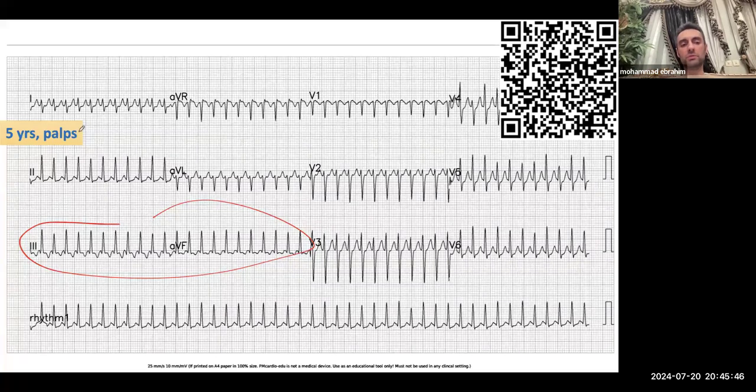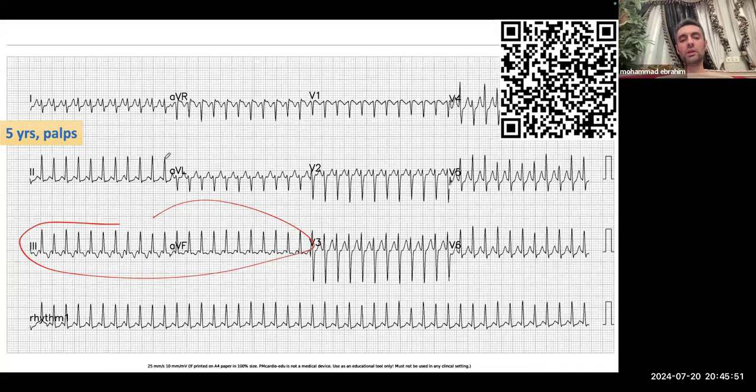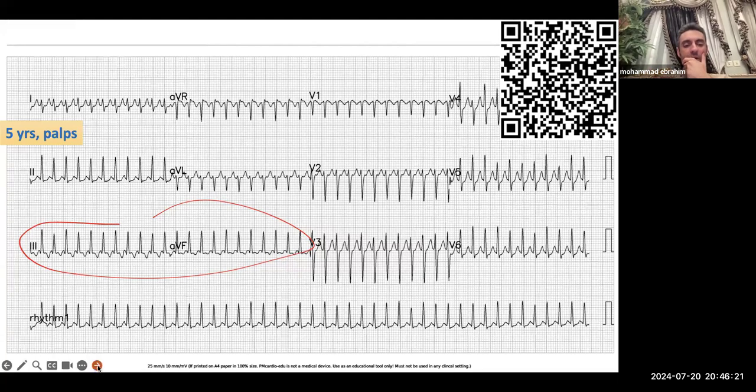Plus, the heart rate here is probably 250, 240, or even faster. So it's very fast, which is against it being sinus, because the maximum heart rate is usually 220 minus the age, and in this case it exceeds 300. It exceeds 220. Okay guys, easy, right? Okay, heart rate 270, I agree. Insane. Okay, so SVT.